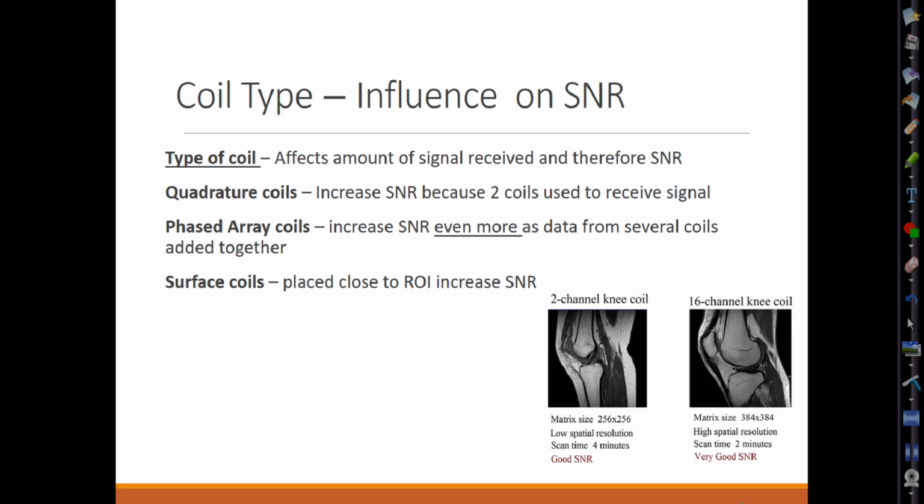Our phase array coil, where do we use a phase array coil? What anatomy? It's fine, good, because we can turn on different sections of that phased array coil. And we have smaller coils that are going to be lying down the entire spine. Because remember, smaller coils usually give us more signal than the larger coils. You get more coverage with the larger coils, but you get better signal from the smaller coils. Say if you have a coil that's 8 centimeters in diameter, how deep does that usually penetrate? 4 to 5, because it's like 50% to 70% of that coil diameter. So good.